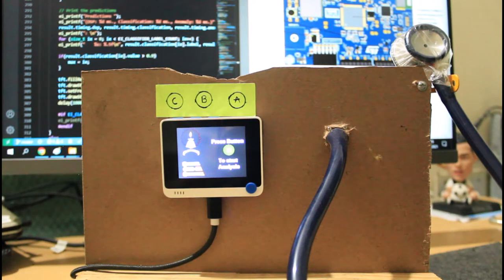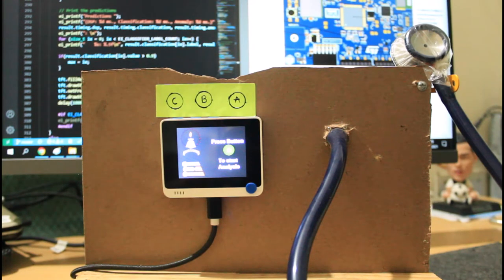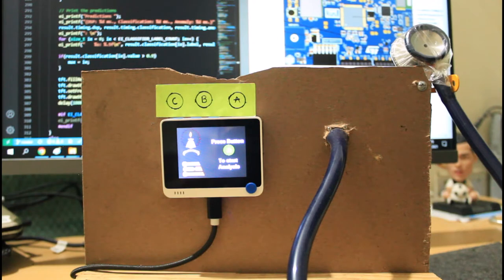Hello, this is a quick demonstration of smart stethoscope on a wire terminal powered by Edge Impulse.